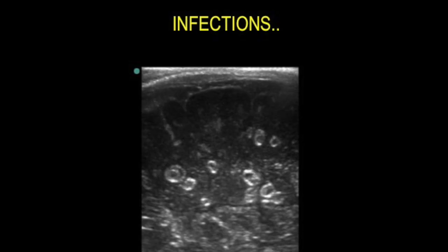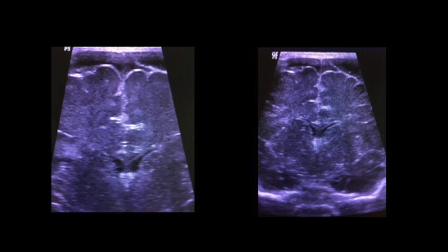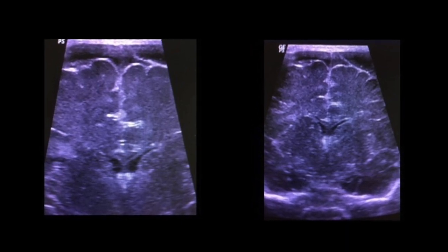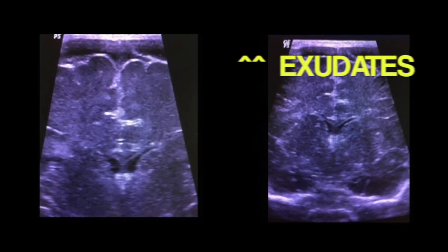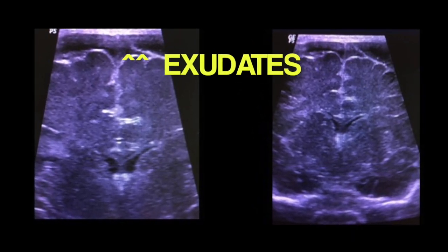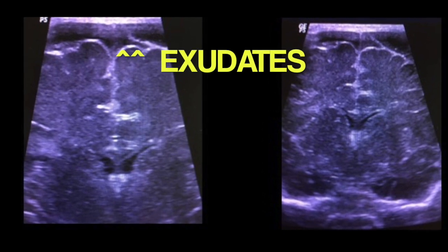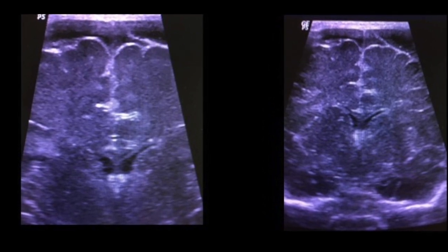Here again you can see echogenic lesions in the brain parenchyma which represent fungal granulomas. This was a case of acute pyogenic meningitis. There is widening of the extra-axial space and you can see some septae and echoes there.